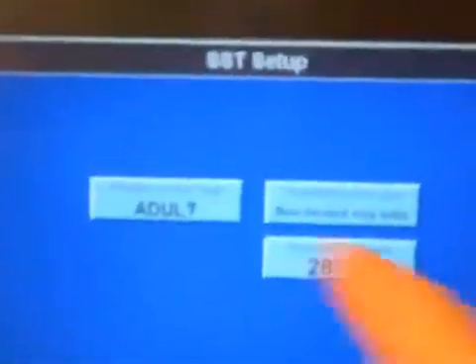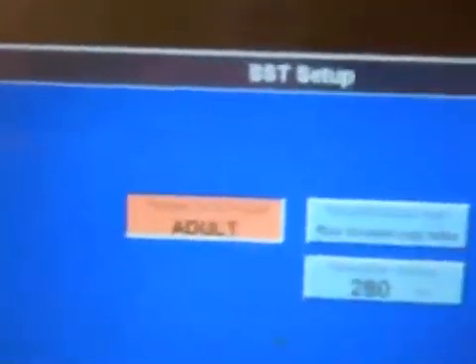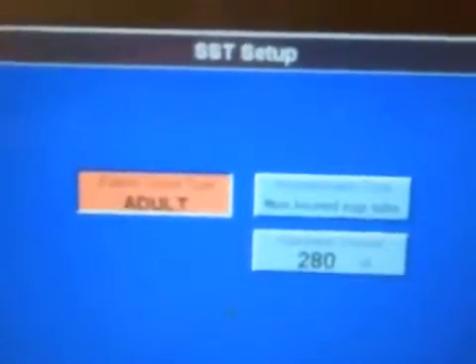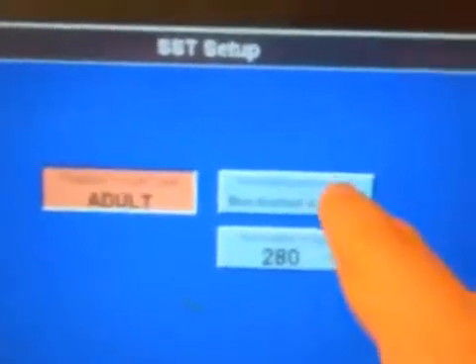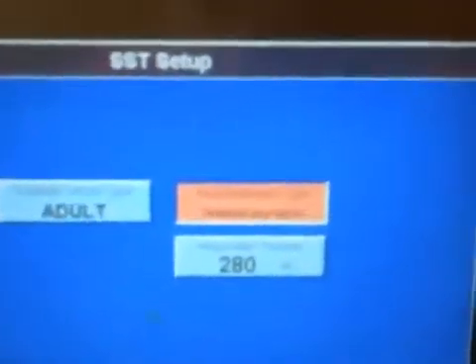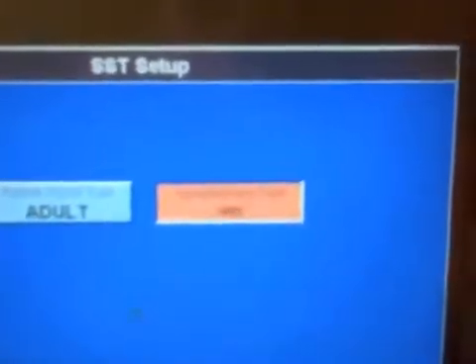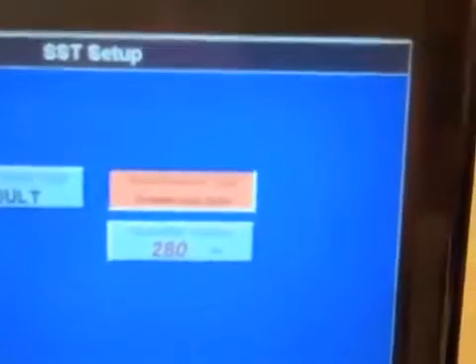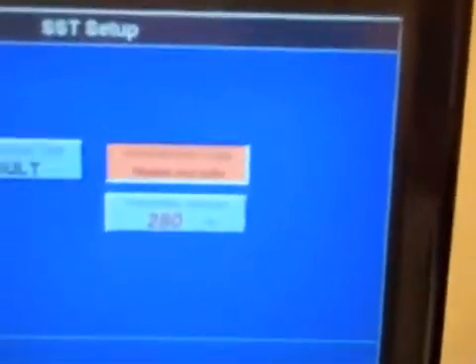What you can do now is input your circuit. So I can do adult, PEDS, or NEO. This is an adult circuit. I can choose either heated or HME. This is heated with a humidifier, so I'll choose this.